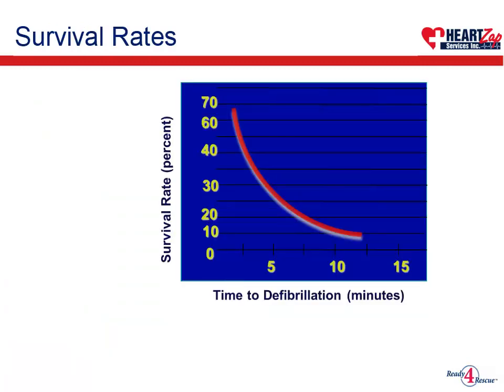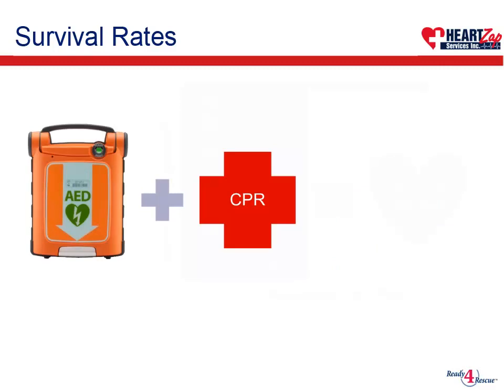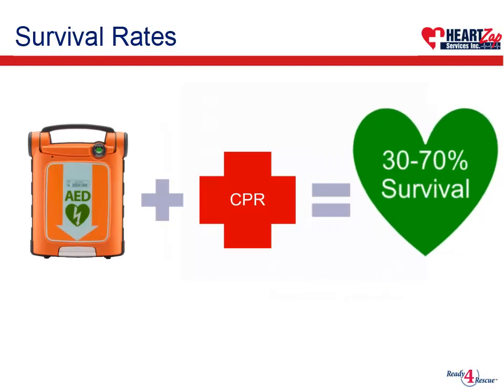Survival rates in people who are experiencing cardiac arrest have been increasing over the years with the use of CPR and AEDs together. This is why AEDs are available for public use. With the use of an AED and high-quality CPR, the chance of survival increases to between 30 and 70%.